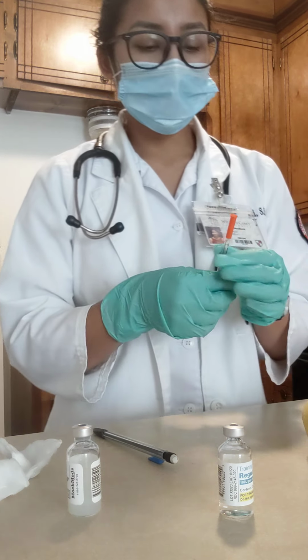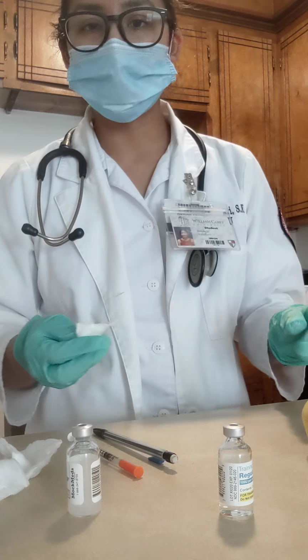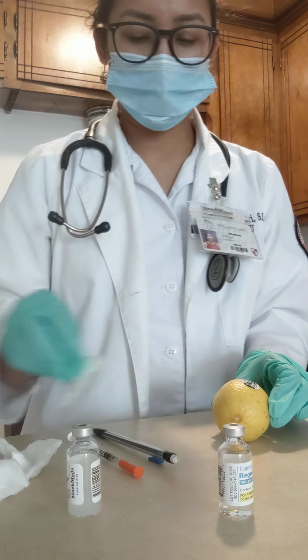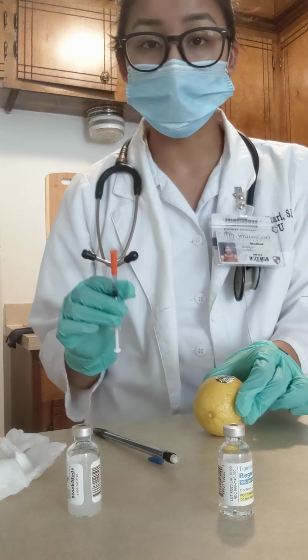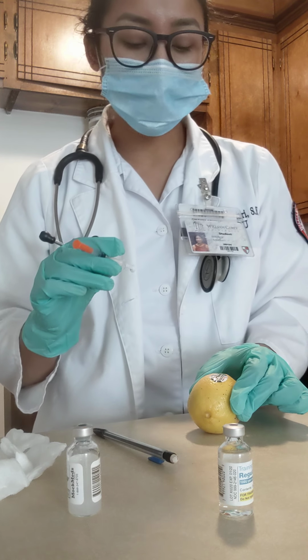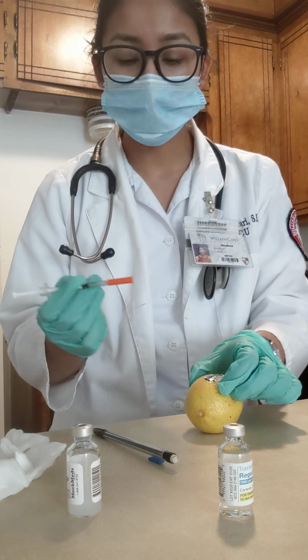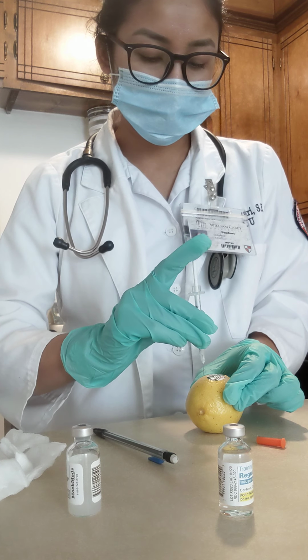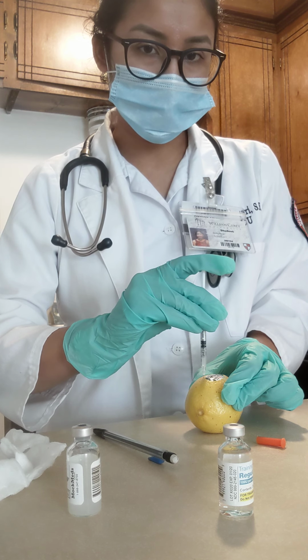So now I'm going to clean the site in a circular motion, which is going to be her abdomen. Let it dry, and I will take my insulin and pinch 2 inches of the patient's skin and administer the insulin at 90 degrees. If it was 1 inch of skin, then I would administer insulin at 45 degrees. I pinch 2 inches of skin and 1, 2, 3. I'll administer insulin slowly.